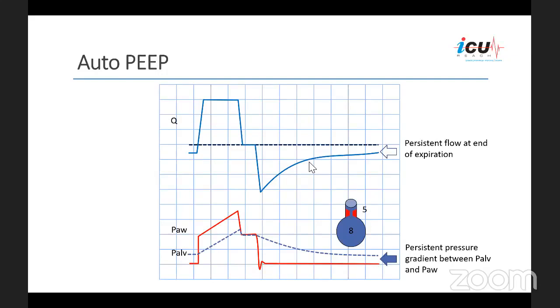So you explain if we add external PEEP when the patient's on volume control ventilation, but in pressure target ventilation, adding additional PEEP beyond auto-PEEP will not increase VT ventilation, but paradoxically might decrease if it is due to stiffness of the lungs. Is this affecting the ventilation, and should we monitor the PCO2?